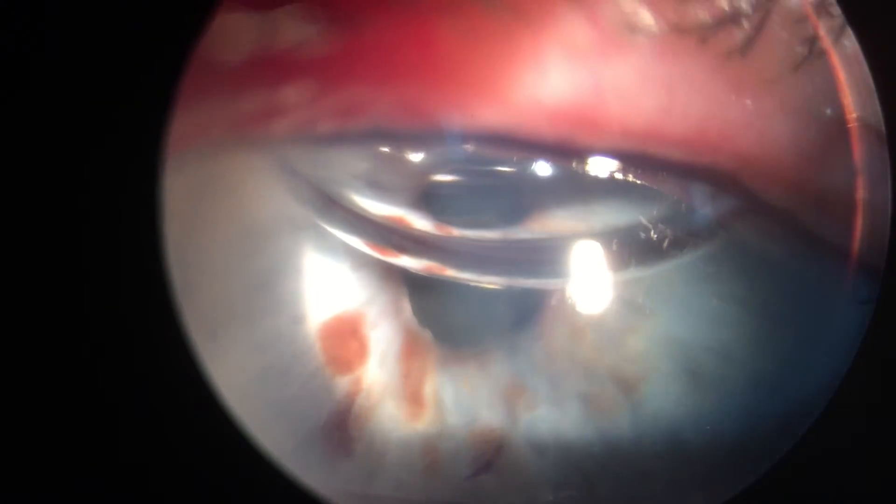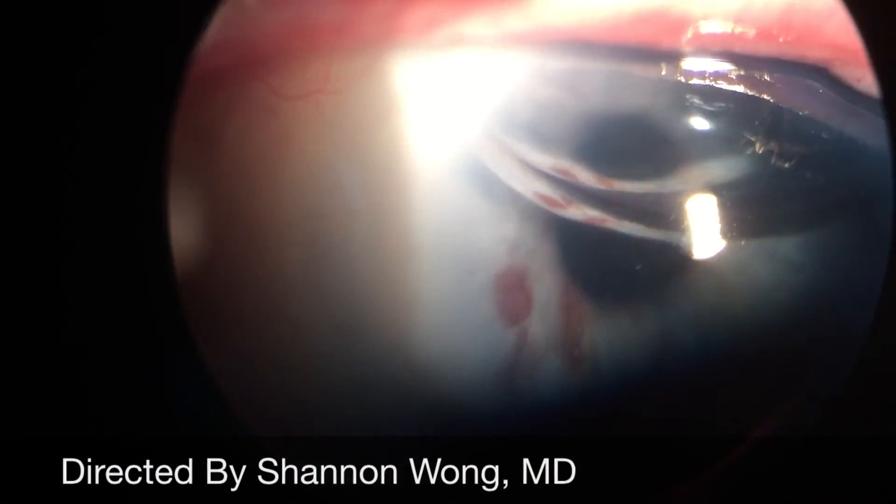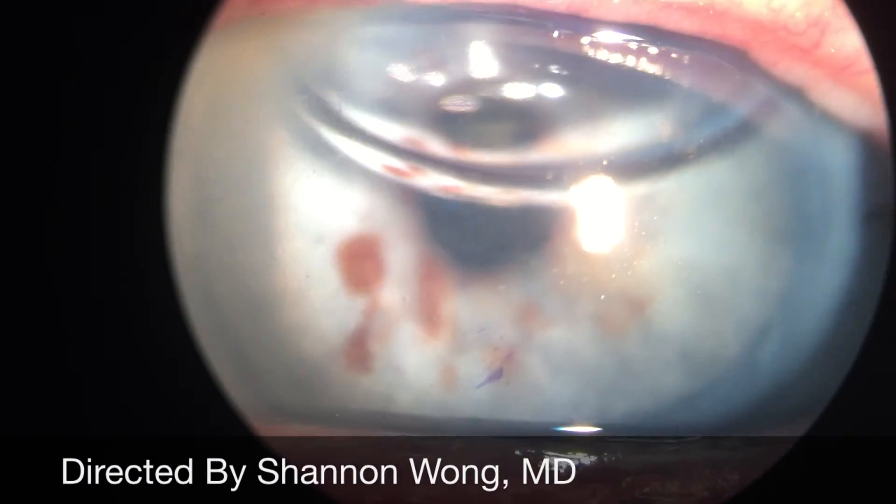This eye, which was legally blind prior to surgery, became an eye that could achieve 20/30 vision without any glasses in less than 24 hours after surgery. We're able to achieve amazing results with this awesome procedure called DMEK. Thank you for your time and attention.